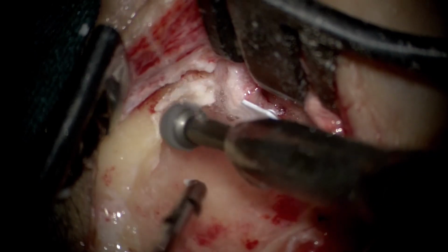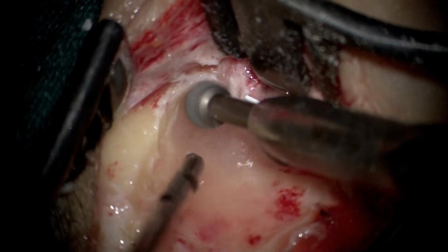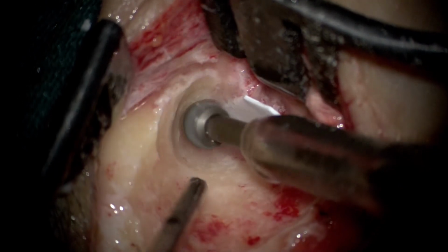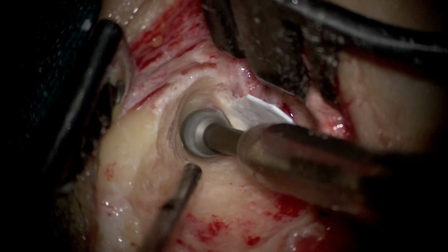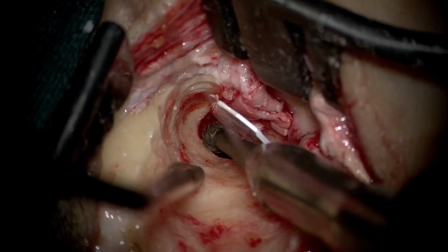This way, we limit the size of mastoid cavity by following the disease in sclerosed mastoids. In sclerosed mastoids, this technique is very handy, and it is generally by default our technique of choice in sclerosed mastoids while encountering cholesteatoma, where our decision to take the canal wall down has been made preoperatively.